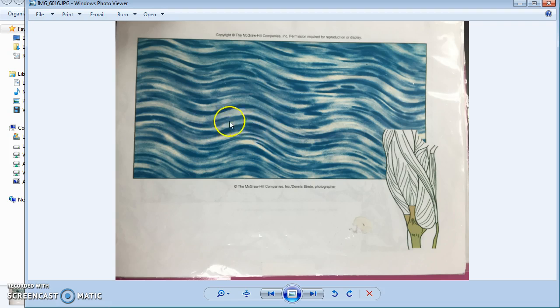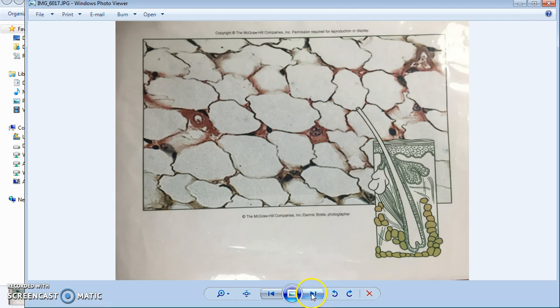Here we have these dense bands of collagen fibers, and the nuclei here are the dark spots, and then the reference point is going to be the tendons or the ligaments of the musculoskeletal system, and so this is going to be dense regular connective tissue. And then here's another picture of that adipose, so large cells filled with triglycerides and cholesterol, and then here it is showing the hypodermis, or the subcutaneous layer of the skin.